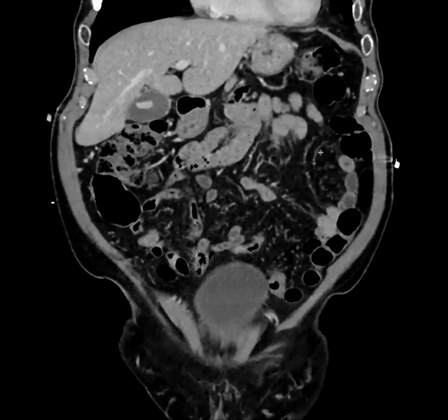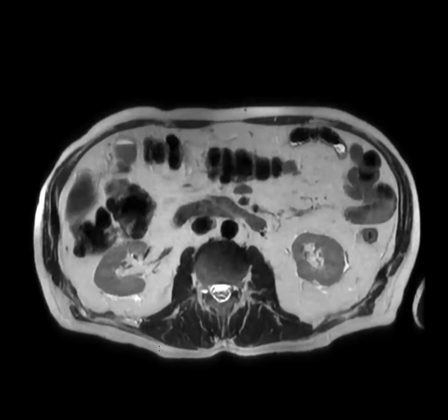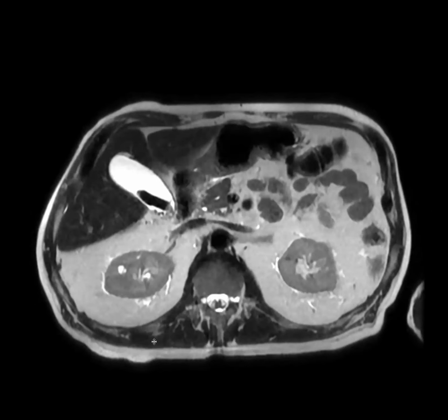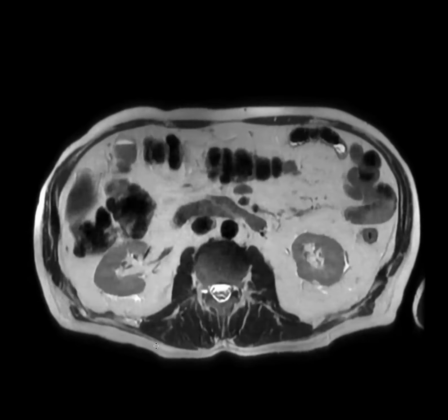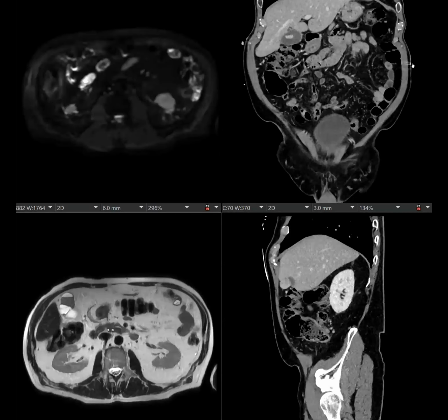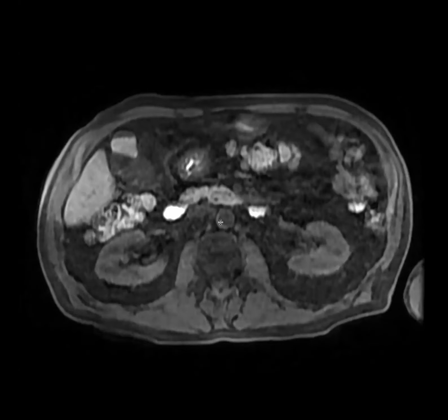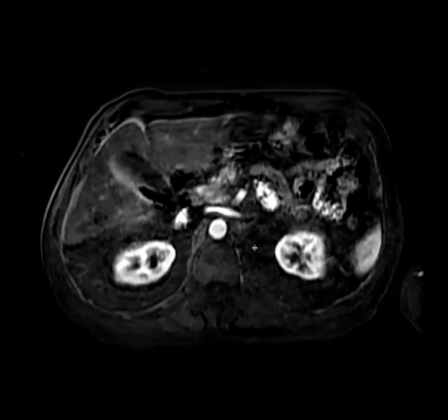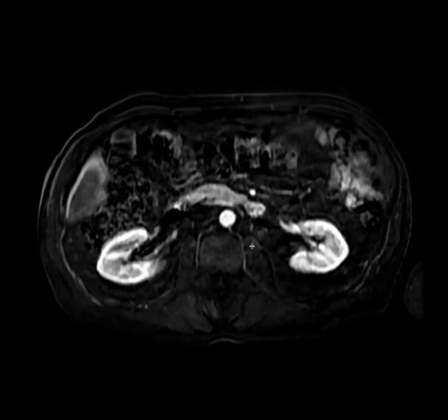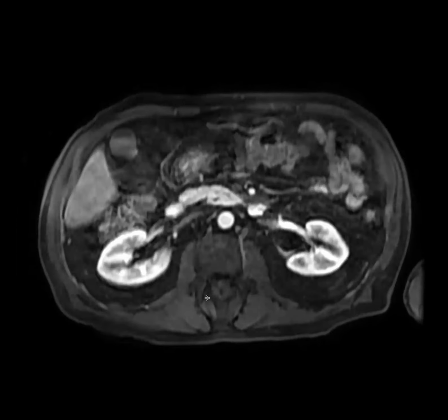Yeah. Wait, show us the MR. Yes, so we got an MR. And I need the drum roll. So this is that luminal linear thing right there. That's your gallbladder finding. And here's our T1. And then here's your subtraction. Oh, that's a misregistration artifact. Yeah, let me just give you sludge. Not enhancing. It's sludge in like a gallbladder fold. Yeah.